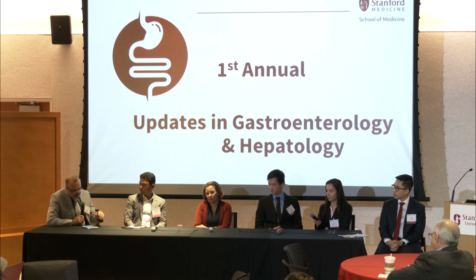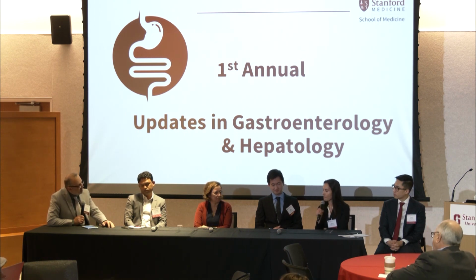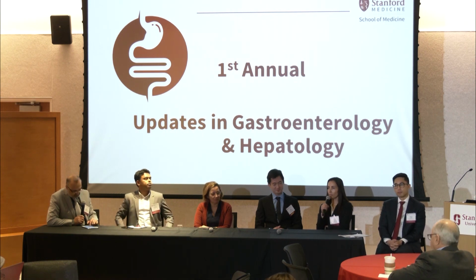You mentioned, and this is a related question, that response to Botox injection might be a predictor for response to GPOEM. Does FLIP play a role in predicting response as well? We actually used to use it, and Juha, you can correct me if I'm wrong, he stopped using FLIP for GPOEMs as well.